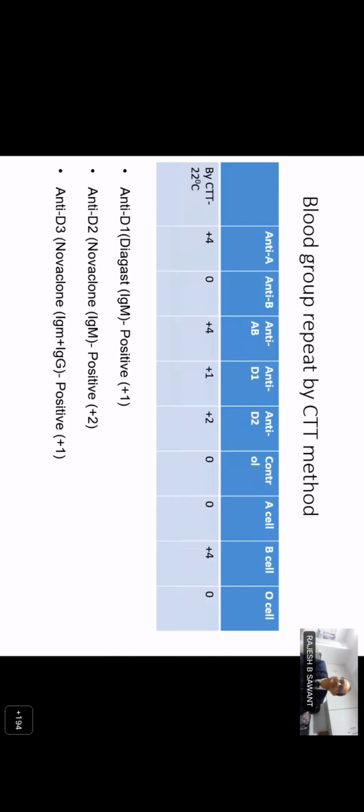Dr. Piyush asks, while doing AHG test, anti-human globulin test, when blood group is negative, to rule out weak D antigen, which type of anti-D should be used, IgG or IgM or blend? A blend, definitely, but you should not interpret with a single anti-D. As I said, at least use 2 different anti-Ds, of which one monoclonal and the other should be polyclonal or a blend.